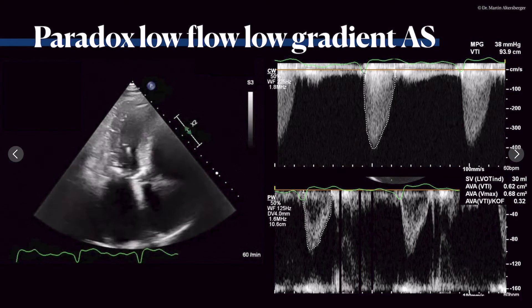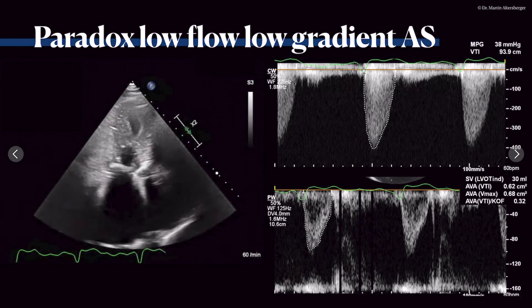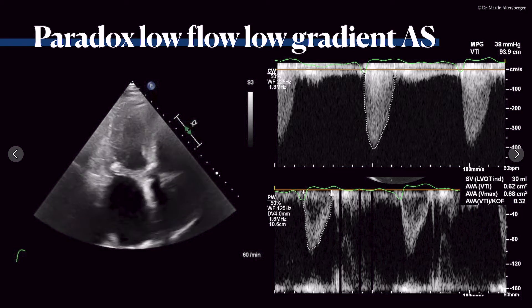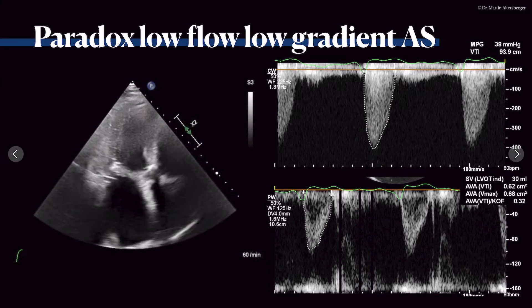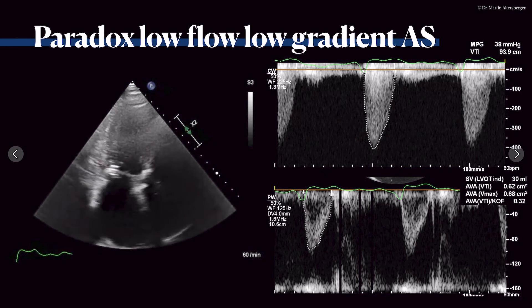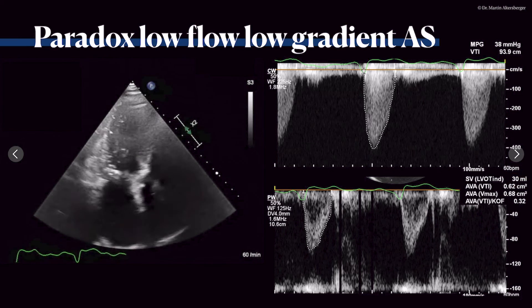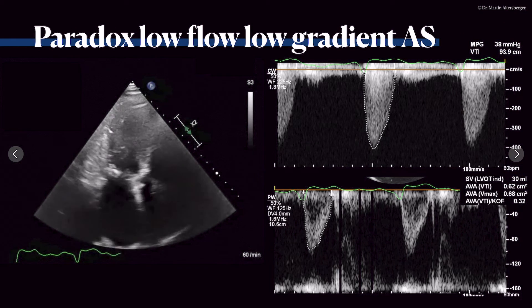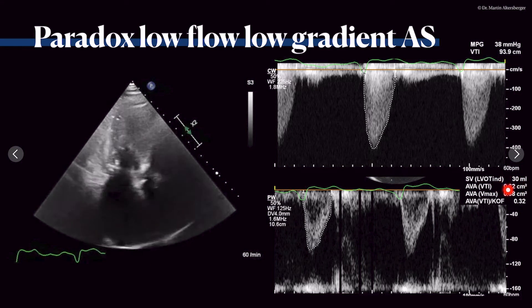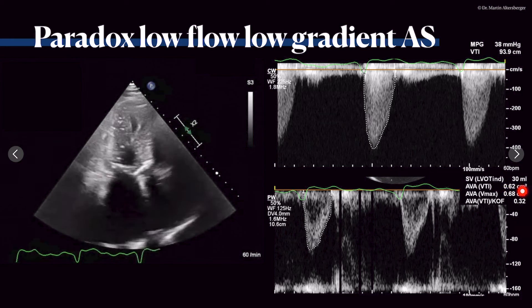Moving on to another entity: the so-called paradox low-flow, low-gradient aortic stenosis. Why paradox? In this case the ventricle is relatively small with good left ventricular function — probably in the high normal range of 55–60%. The aortic valve is severely calcified. However, the stroke volume index is still below 35 mL/m² and the mean pressure gradient does not exceed 40 mmHg, with an aortic valve area of 0.62 square centimeters — despite a preserved ejection fraction.